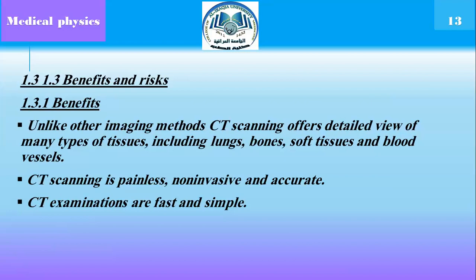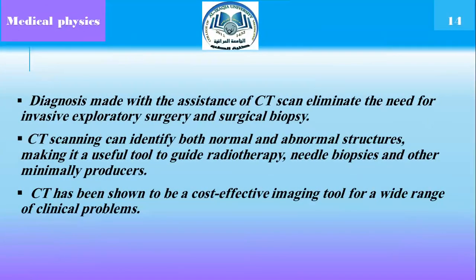CT scanning is painless, non-invasive, and accurate. CT examinations are fast and simple. Diagnosis made with the assistance of the CT scan eliminates the need for invasive exploratory surgery and surgical biopsy.